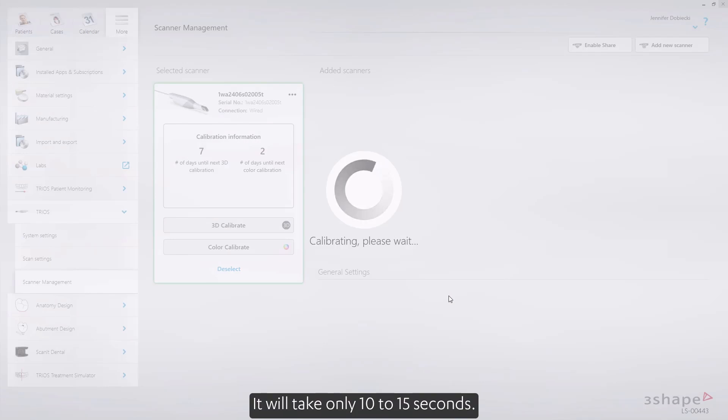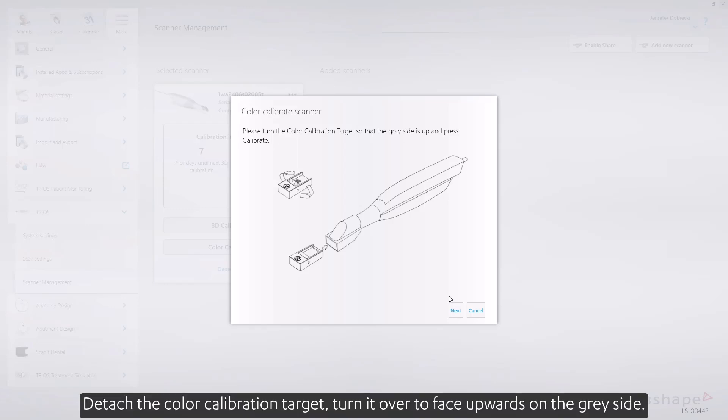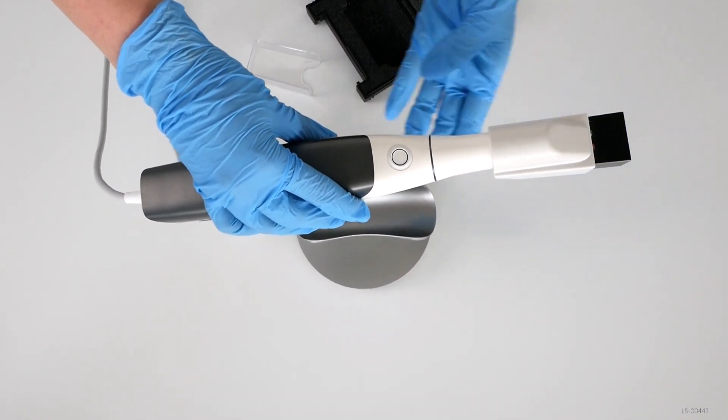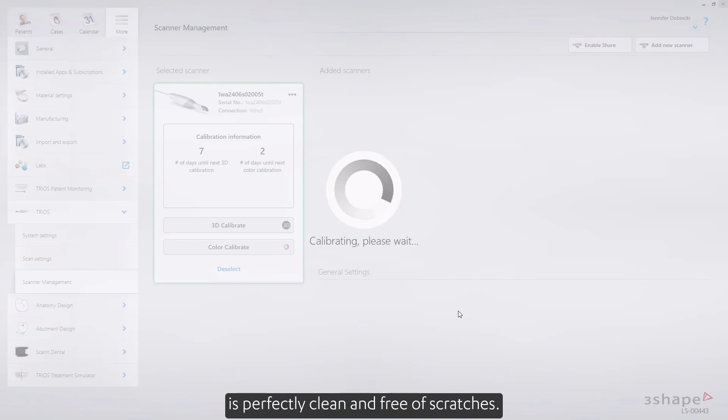It will take only 10 to 15 seconds. The next step is preparing for validation. Detach the color calibration target and turn it over to face upwards on the gray side. While performing this action, make sure that the gray surface is perfectly clean and free of scratches. Upon doing so, reattach it to the color calibration adapter and press Calibrate to start validation. It takes about 30 seconds.